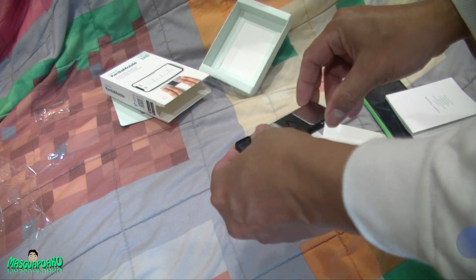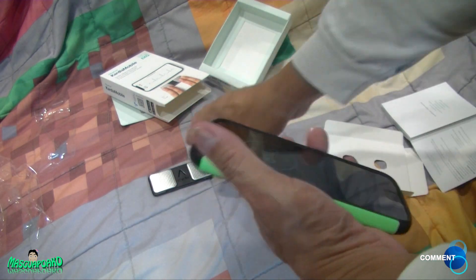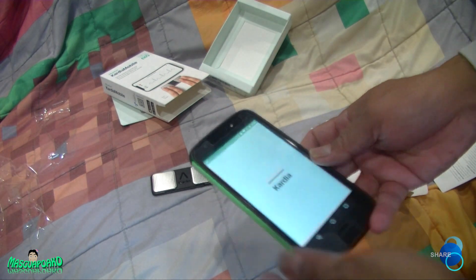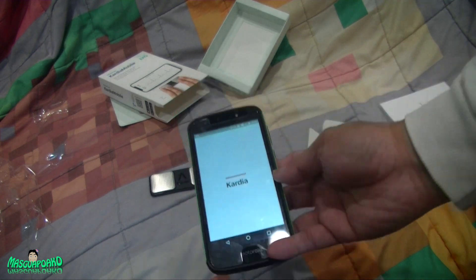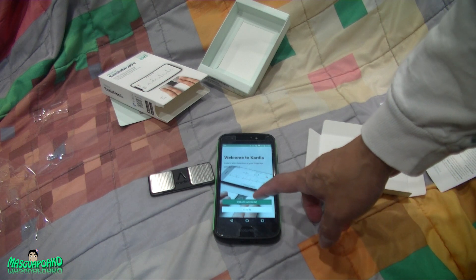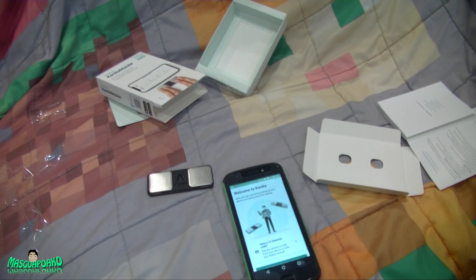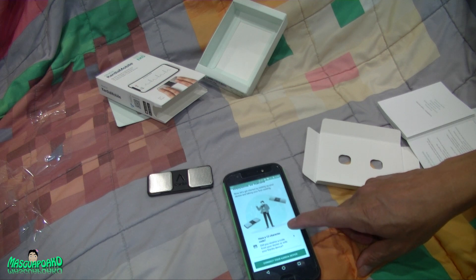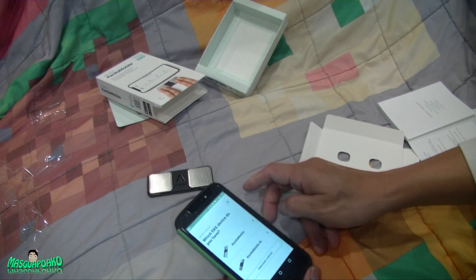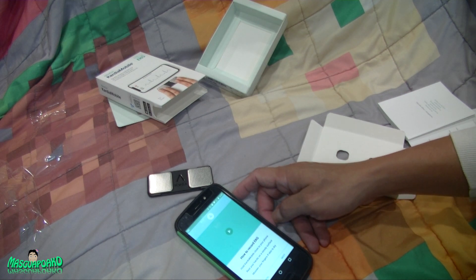The app is done — open it. I'm going to create an account. I don't want to give my info so I'll try to do this offline. There's a character code — did you receive a code from a doctor? No. Disconnect.